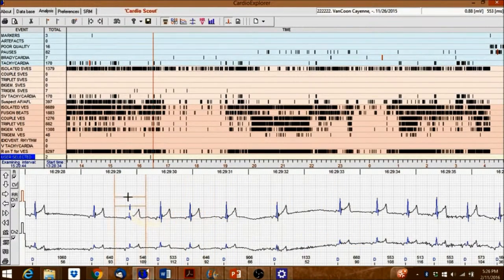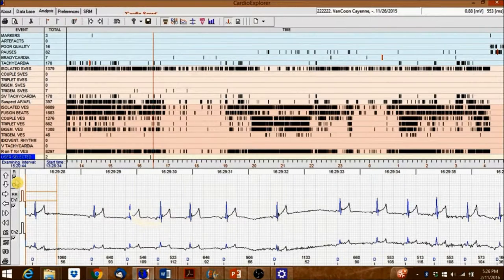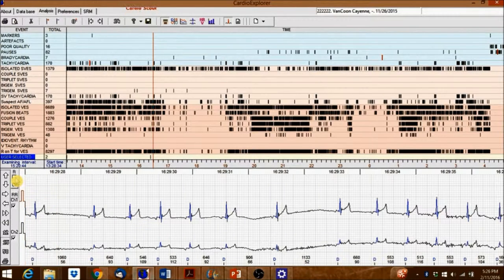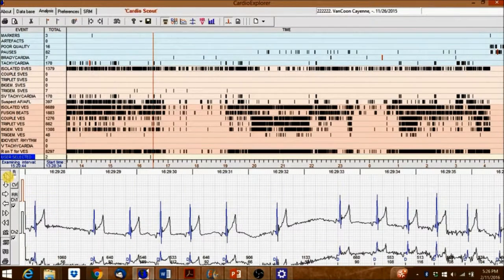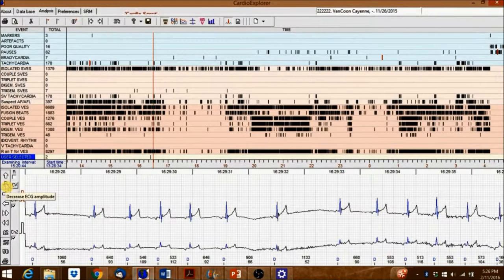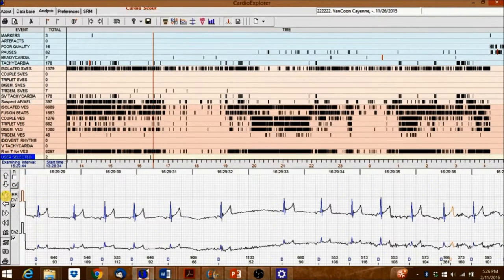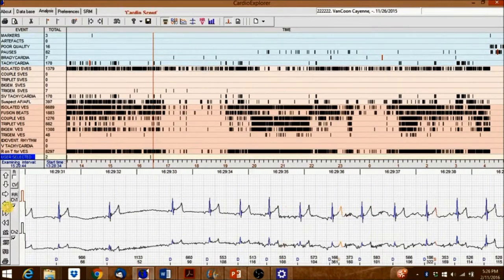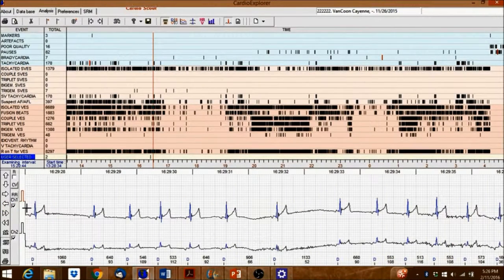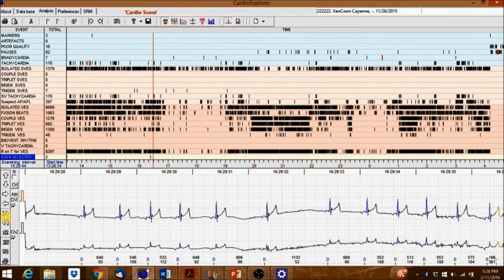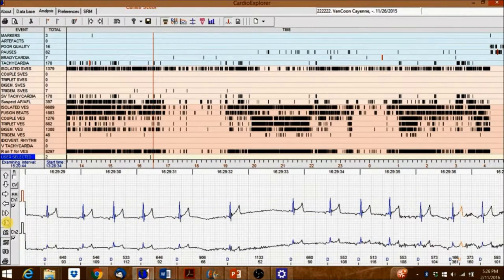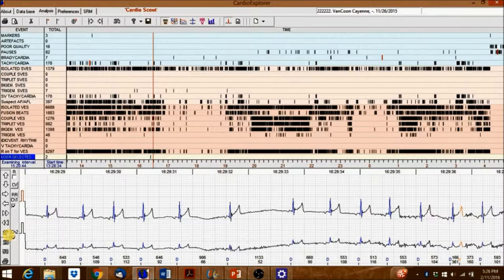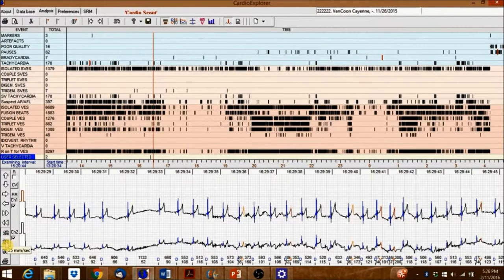At the vertical menu bar to the left you can click the up-down arrows to increase or decrease signal amplitude. The left and right arrows will move the recording one second to the left or one second to the right. The double arrows will play the recording and 12, 25, and 50 will change the paper speed.